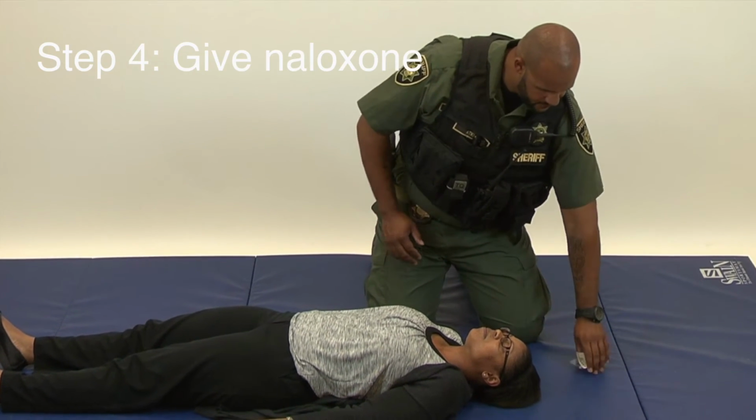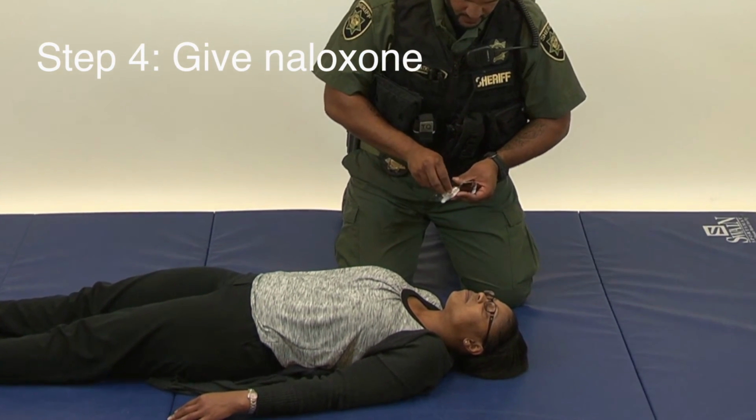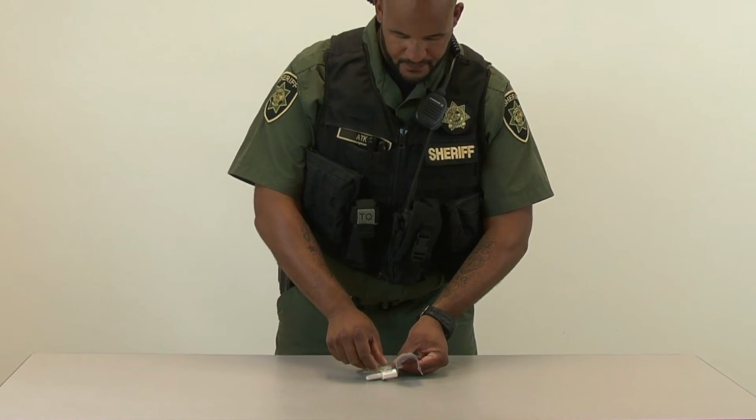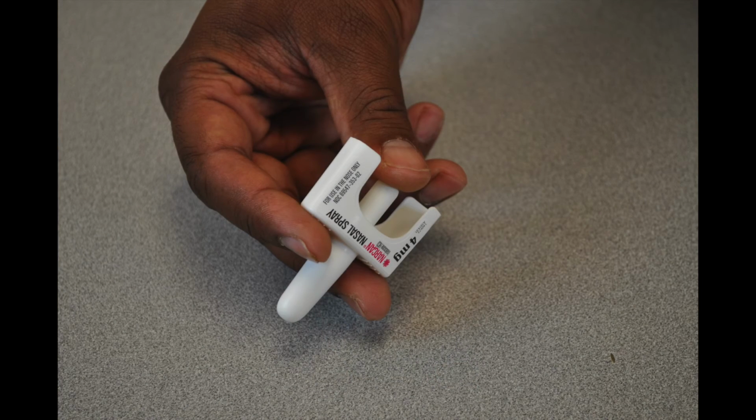Step 4. Give naloxone. If the person is still not breathing, it is time to use your naloxone. Peel back the tab with the circle to open the nasal spray. Hold the naloxone with your thumb on the bottom of the plunger and your first and middle fingers on either side of the nozzle.